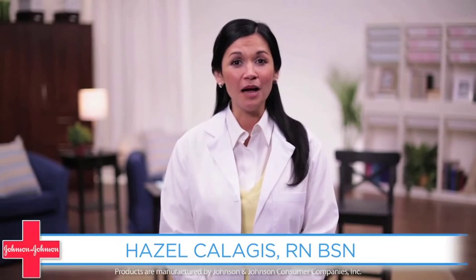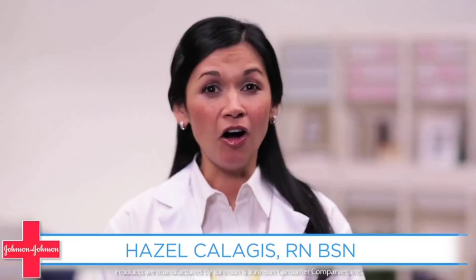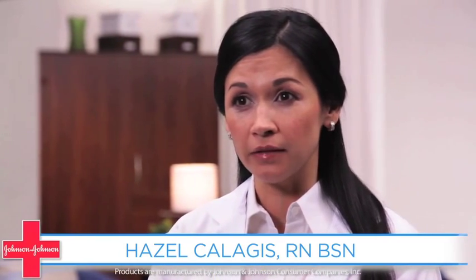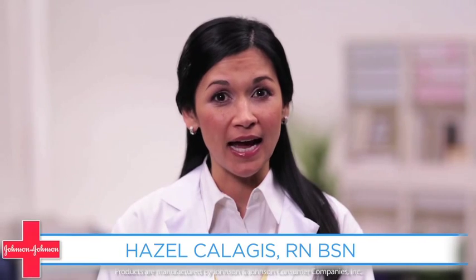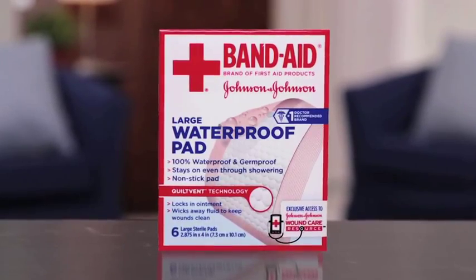Hi, I'm Hazel. I'm a registered nurse and I'm proud to work for Johnson & Johnson. Oftentimes surgical wounds need to be kept dry in order to heal effectively. This can make showering a difficult task. If your doctor has allowed you to shower, here's how you can do so safely using waterproof pads.